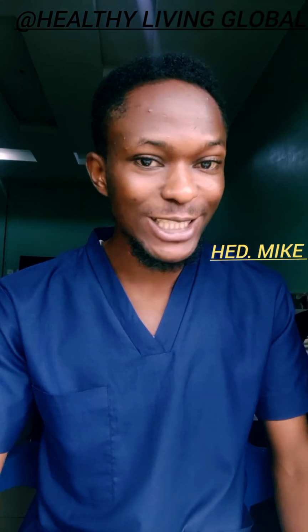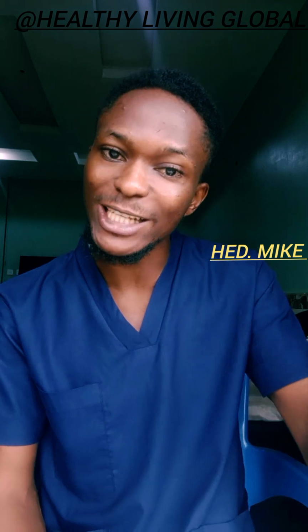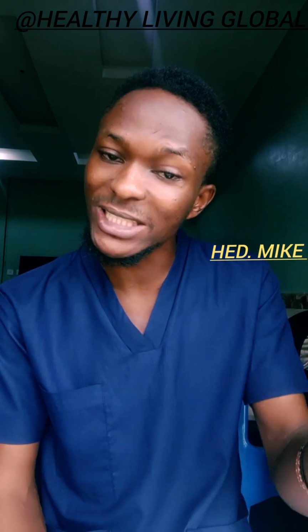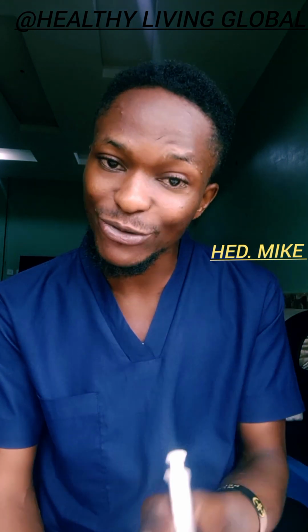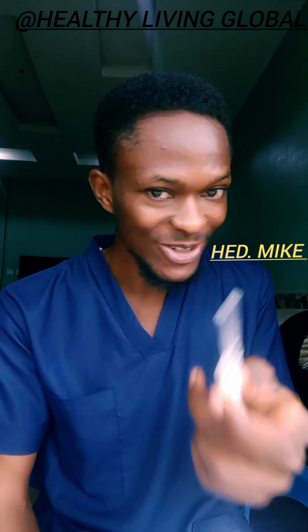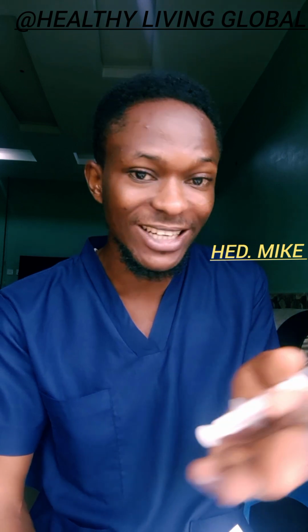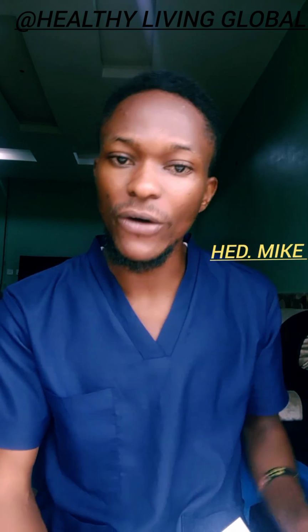Another goal is that you try as much as possible not to transmit an infection or a disease from the patient to yourself, because if you are not careful, when you put the needle back in the cap and it pierces your hand, you know what it can result to. Many people have contracted HIV and other diseases through this. Be careful. All right, let's go now.